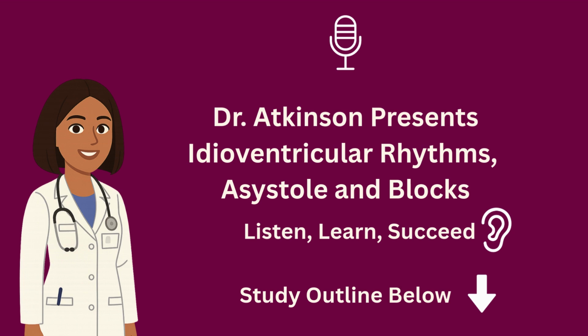Complete heart block, or third-degree AV block, is when none of the atrial impulses get through to the ventricles. The atria and ventricles beat independently, a situation called AV dissociation. On the ECG, you'll see P waves marching along without any relationship to the QRS complexes. The ventricular rate is usually slow, depending on whether the escape rhythm comes from the junction or the ventricles themselves. Patients often feel weak, may faint, or even develop shock. The definitive treatment is pacing, first temporary, and then, for most, a permanent pacemaker.